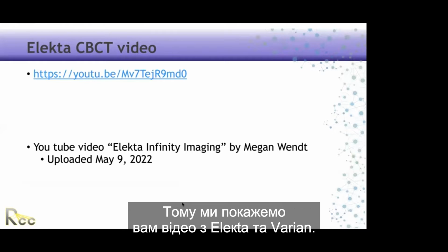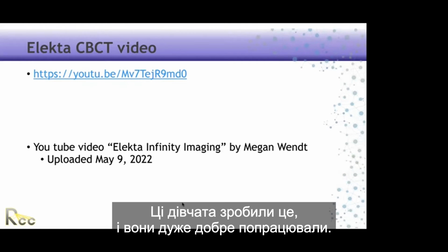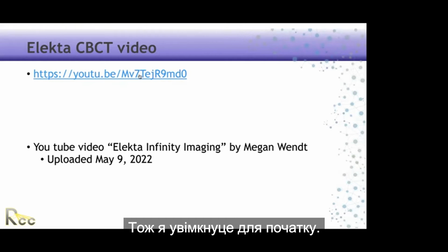So we'll show you videos from both Elekta and Varian. But this was a really good YouTube video, so I'm going to play this for you. I didn't make this. These girls made it, and they did a really good job. So I'm going to play this just to start.